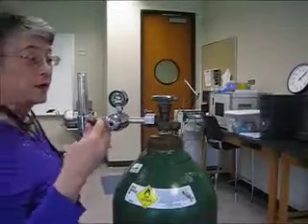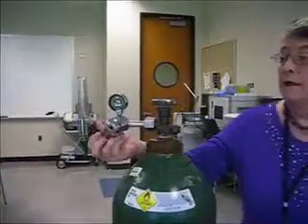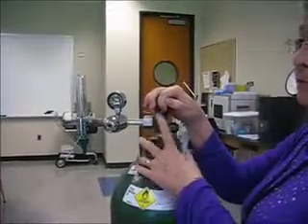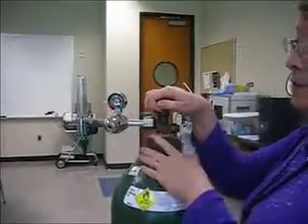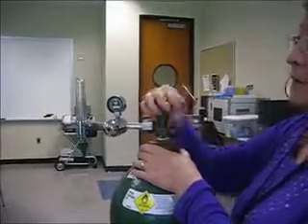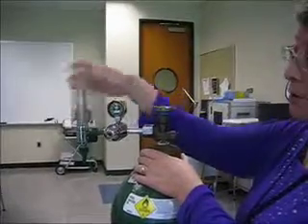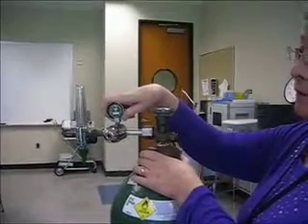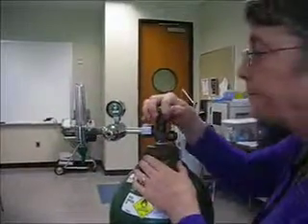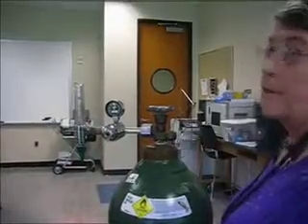Now that I've got this set up, I want to have this turned off. I think this is off. We'll find out. And I'm going to open the valve stem, and the gas is going to go into the regulator. Okay, it was closed. Now, it hopped because this is a compensated flow meter. This is a Thorpe tube, and this, of course, is our Bourdon gauge, and together it's all called the regulator. I can turn my flow on, give my patient his oxygen.